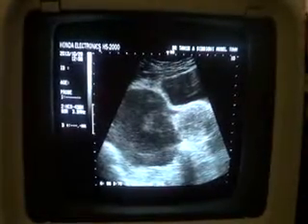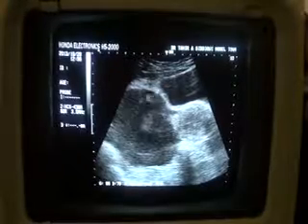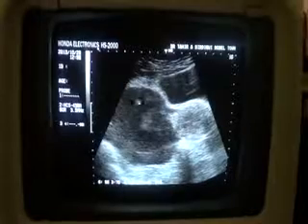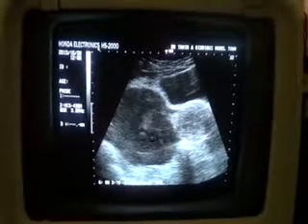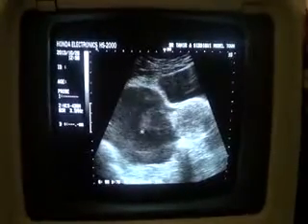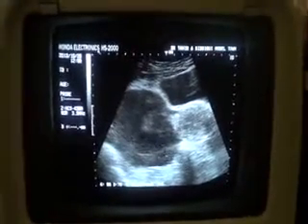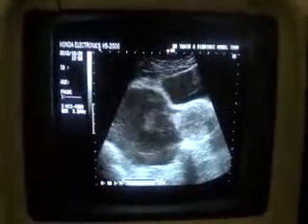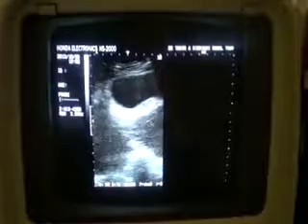This is the uterus in transverse section. This is the cyst, and this is the debris, and this is relatively fluid, clear of the debris. So there are internal echoes within this, no calcification, and no solid element is seen within this cystic area in the region of the right adnexal.